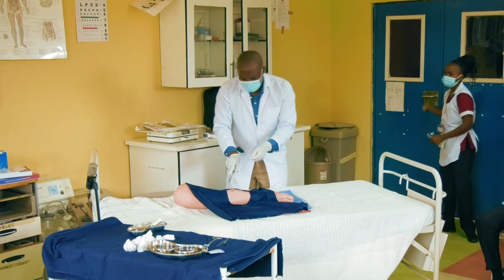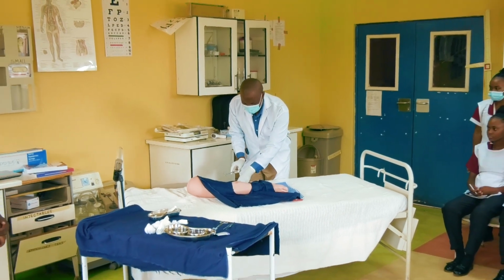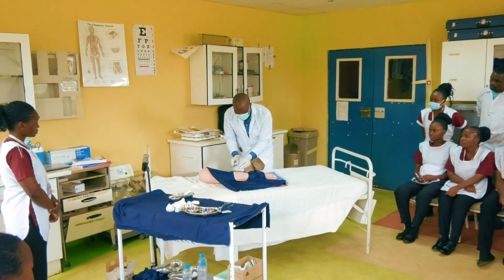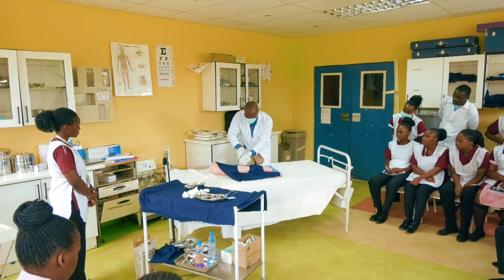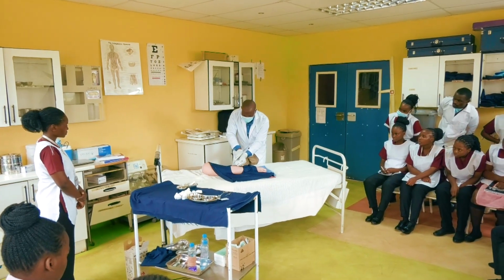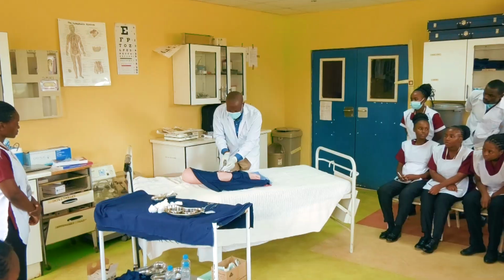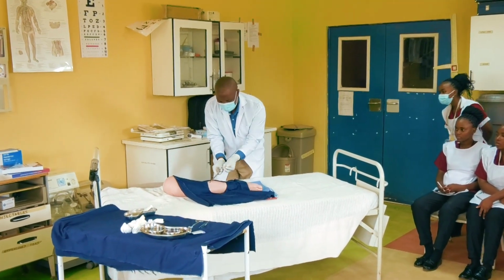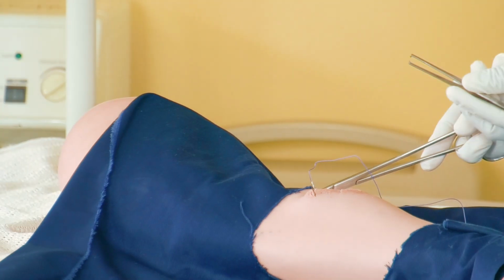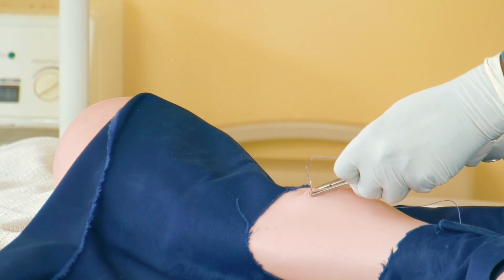So what you do is you start from up there. Okay, I'll pick my tooth dissecting forceps. I'll slightly go into the wound. I hold this part of the skin, push the needle down. Remember, the patient is not feeling any pain, right? Yes. Then, once the needle is out there, I'll use this same forceps. As I hold, I remove this.